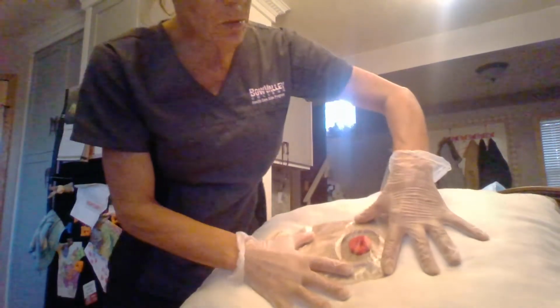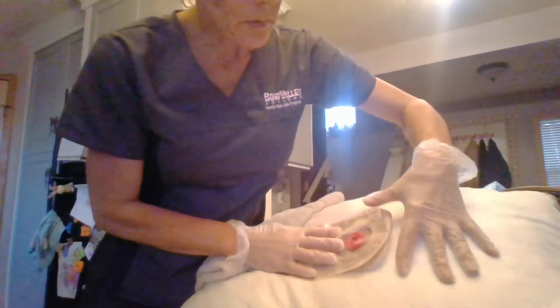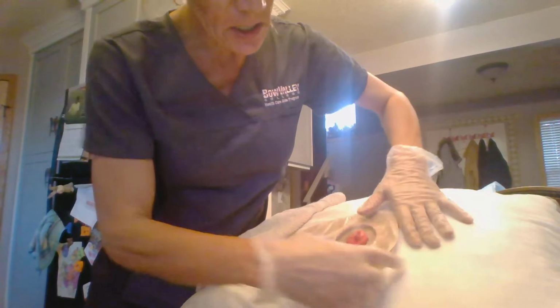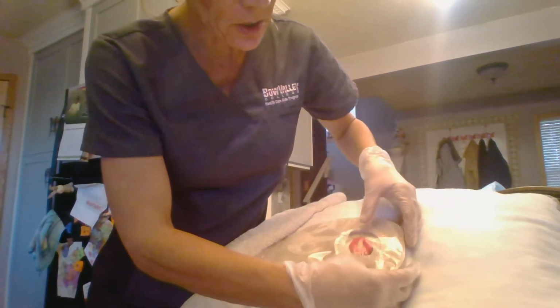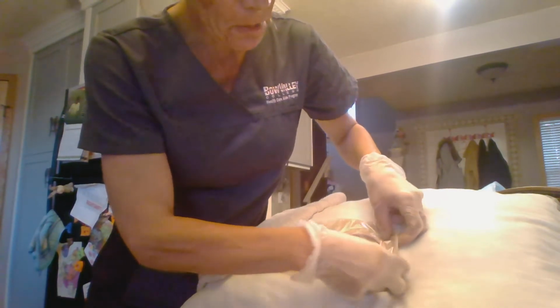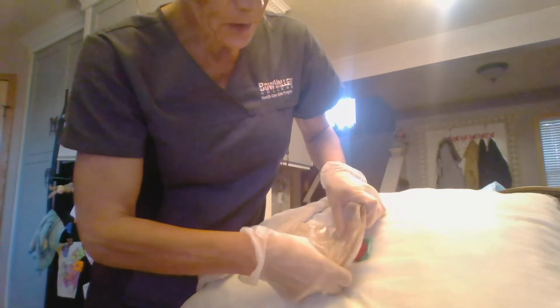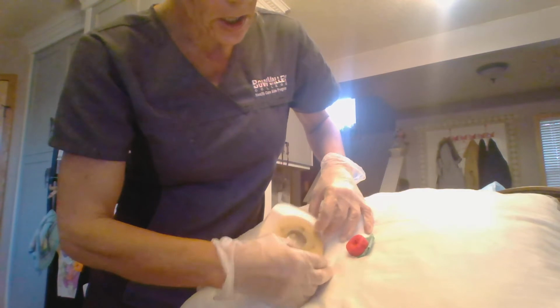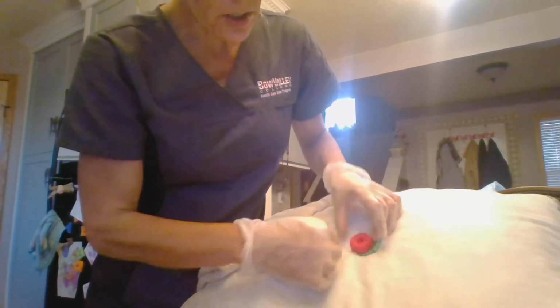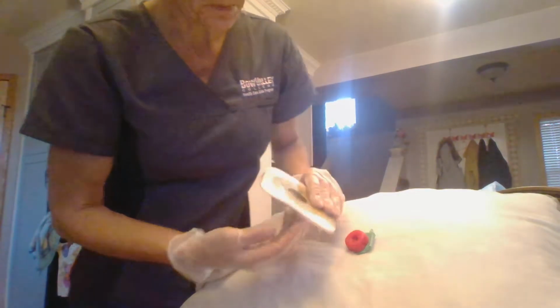So when we remove the system, we hold the skin tight with slight pressure. Not hold it, put pressure on the skin. Start from the top and remove the system downward. Possibly trying to mask the odors that would come from it. If there's any adhesion in this area, you can remove it with the adhesive remover.